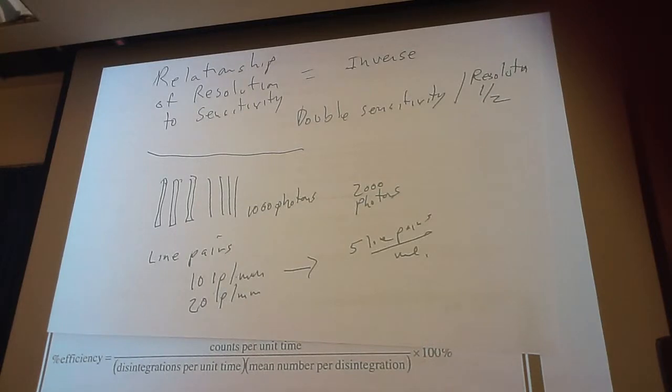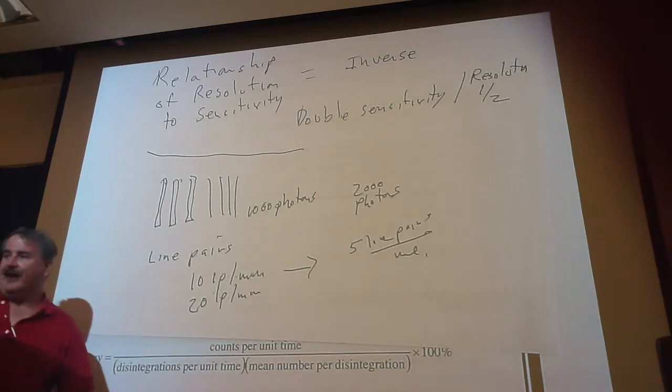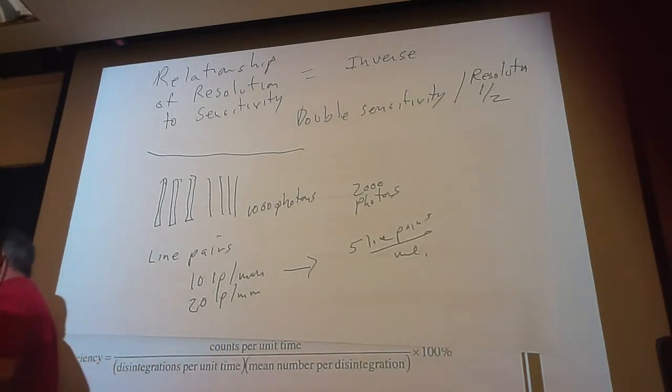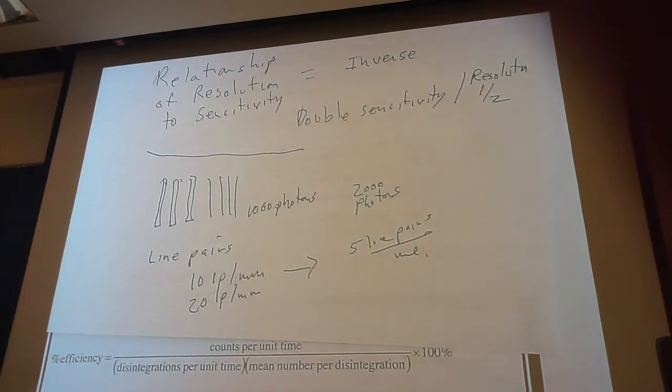So we've been in a hospital now for almost a year, and isn't it pixels, like 800 by 600? Well, that's what you're putting in. That's what you think you're getting, right? Because that's what the computer tells you you're getting. So none of you guys have checked the resolution of your monitors, huh?